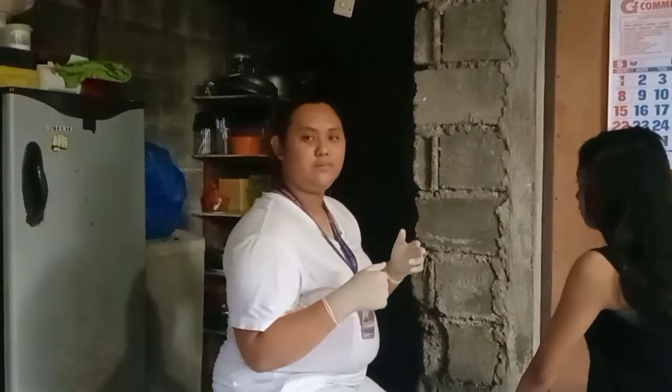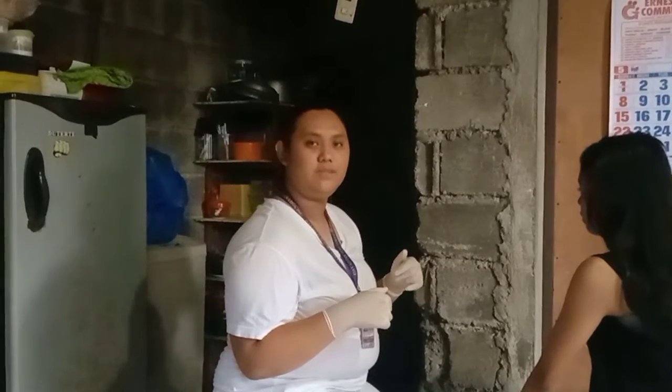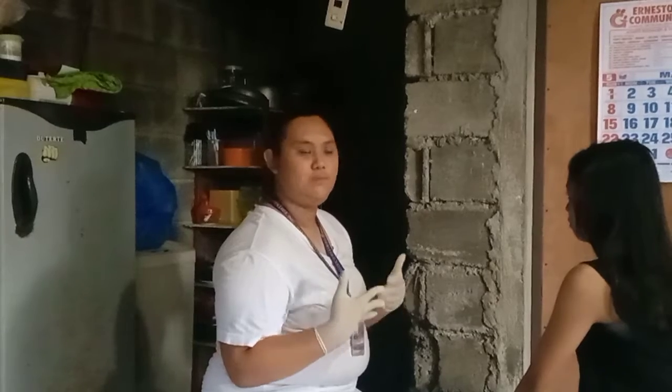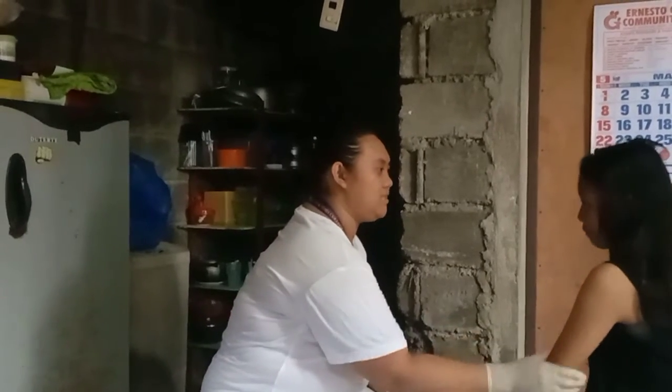Help the patient to find a comfortable position that will accommodate the injection site you've chosen. Expose only the portion of the body needed so that the patient will be comfortable during the assessment, and some body parts also need to be kept confidential. Are you comfortable in here? If I inject your arm here.